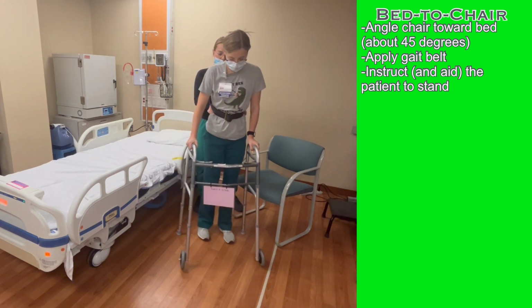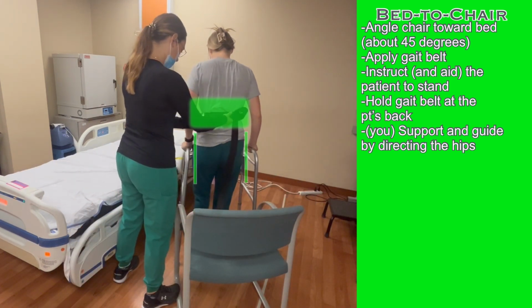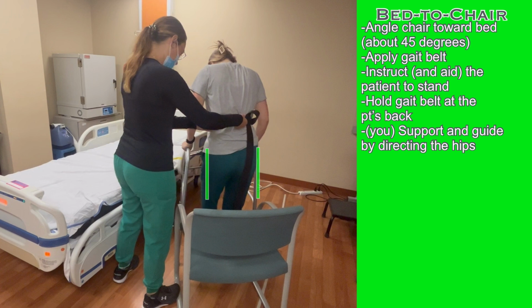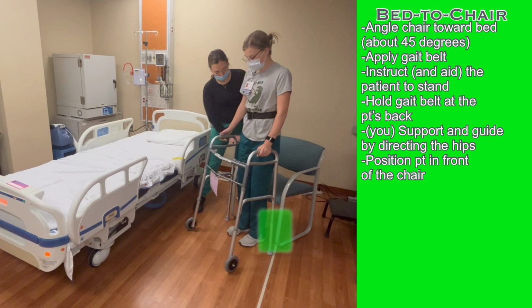Help the patient by supporting from the gait belt and holding it in the back of the patient, and guiding from the hips. Guide them as they turn their walker until they are in position in front of the chair. The patient should be directly in front of the chair, with the back of their legs almost touching it. The walker should be directly in front of the patient, nice and close, also nearly touching the chair.